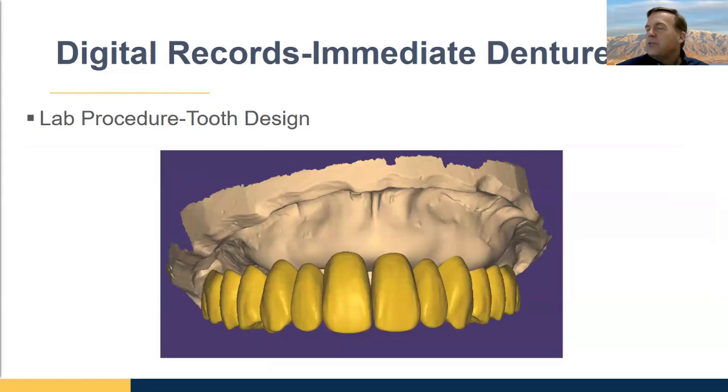So once you've got the teeth extracted, then we can do our tooth design. With digital dentures, there are basically 3 workflows. You can do what's called carded teeth.